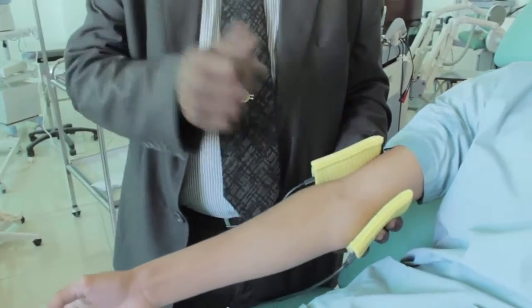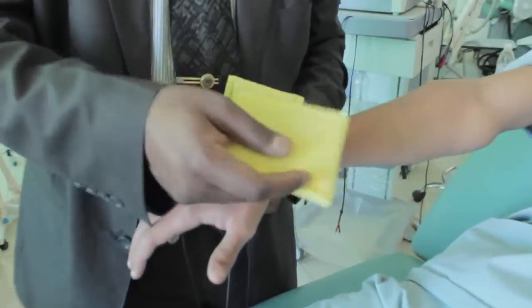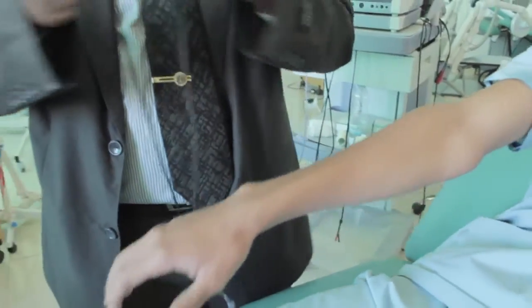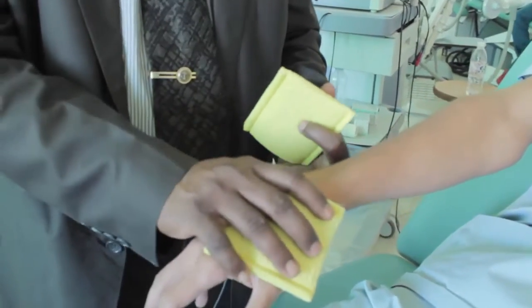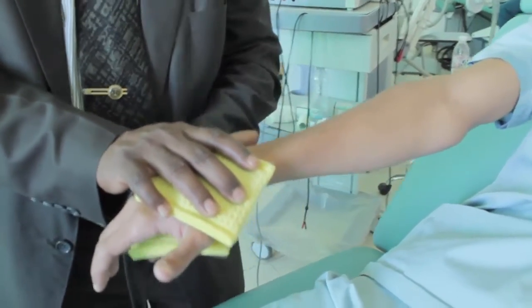If it is De Quervain's disease, problem with the tendons of the thumb, then anode on the tendons, cathode on the opposite place, or here or here.